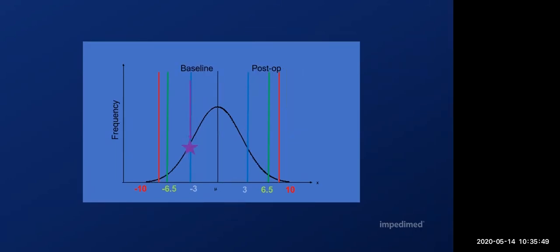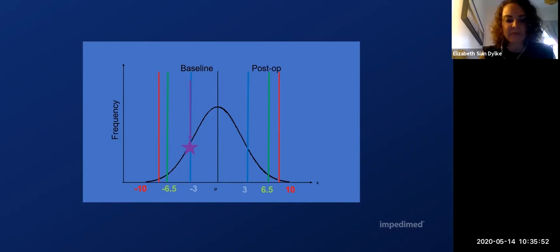However, absolute thresholds like an L-Dex of 10 may not capture everyone who has significant changes in their extracellular fluid volume. For this patient, their pre-surgery L-Dex was -3, a perfectly normal interlimb ratio that puts them about 1 standard deviation below the normal average. When they are assessed at a later date after treatment has occurred, they now have an L-Dex of 7, putting them still significantly below the 10 L-Dex threshold. The shift in L-Dex, though, is large at 10 points. Patients like this are the primary reason for including pre-surgical measurements wherever possible.